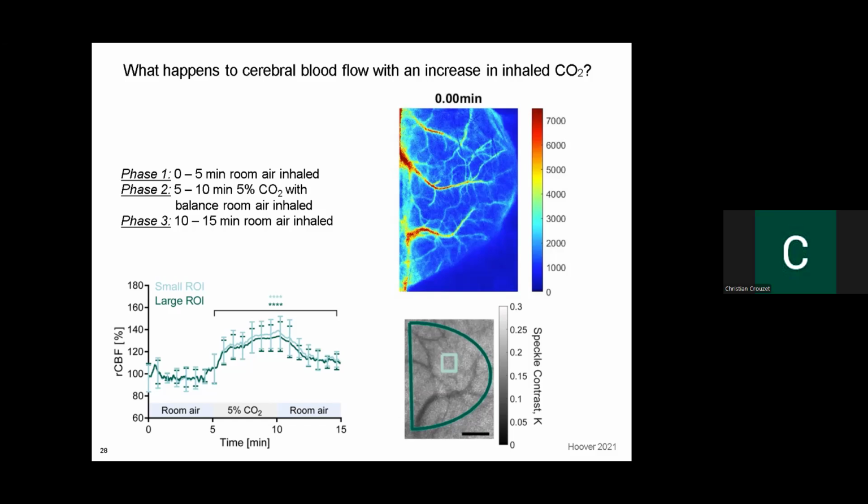That's a good question. So inherently, a laser is more polarized. Oh, sorry. The question was, do we use polarized light when sending it into the tissue? Inherently, the laser does have pretty good polarization, but we typically do polarize the light with a polarizer. And on the detection end, we have a cross-polarized detection to minimize surface reflections.